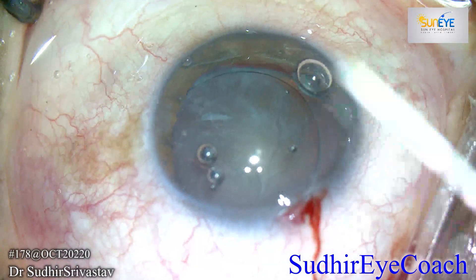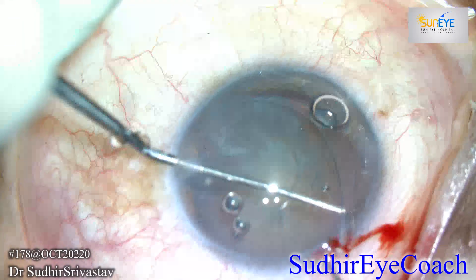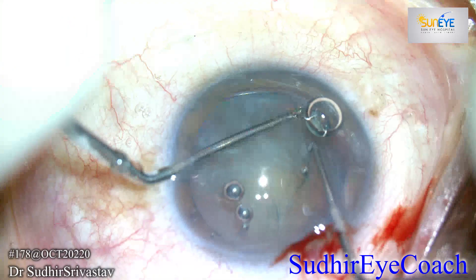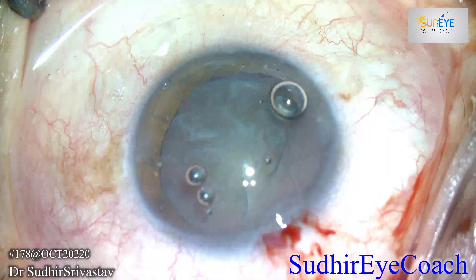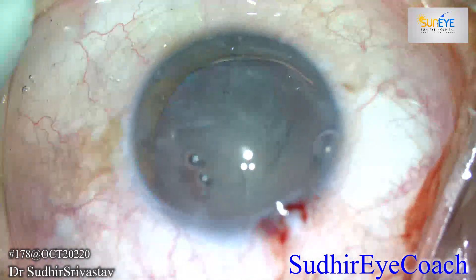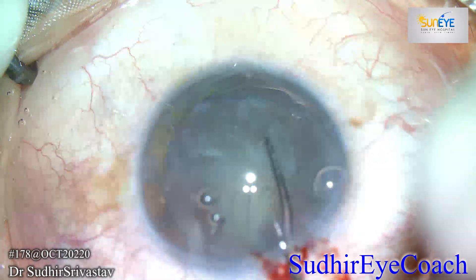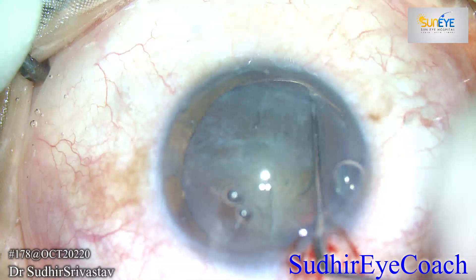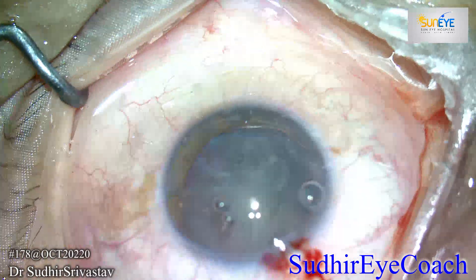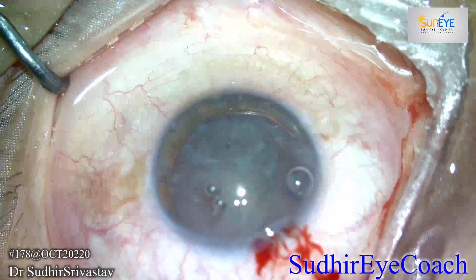Otherwise it can stretch the remaining area of the zonules and you may end up with more subluxation of the whole lens complex. You can use the bimanual technique where you hook the hole and with the second instrument release it and place it in the bag. Before starting phacoemulsification, I said your endocapsular ring must be in a proper place. I double-checked and was pretty happy that my ring is inside the capsular bag, because if it opens in the sulcus area it is very difficult to bring it back into the capsule.